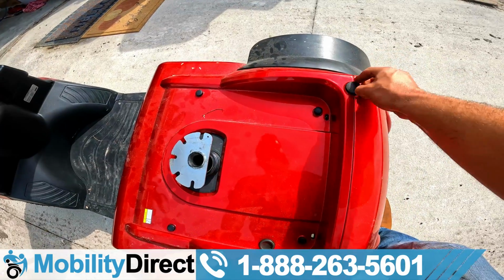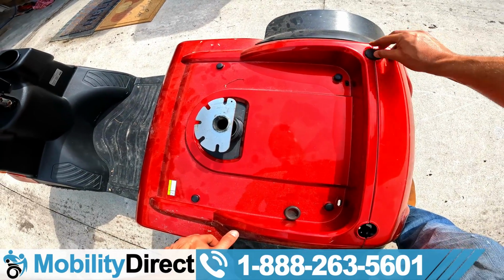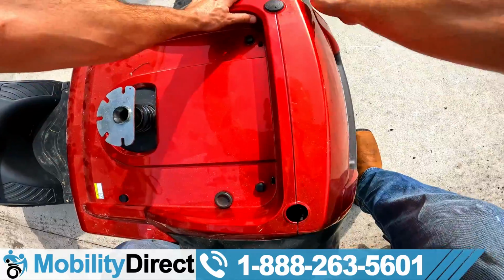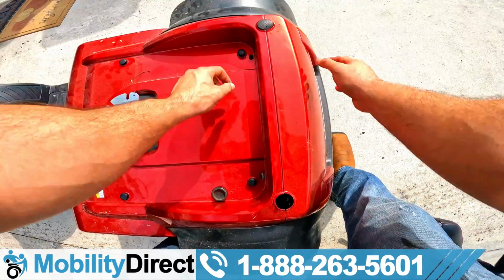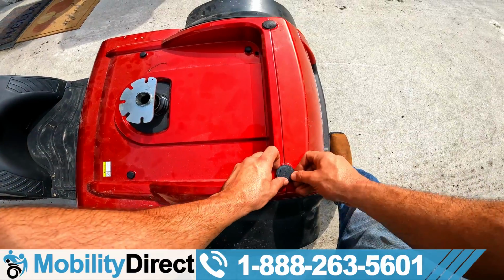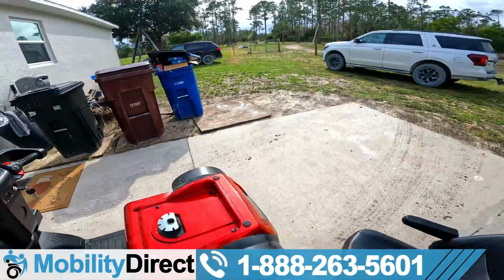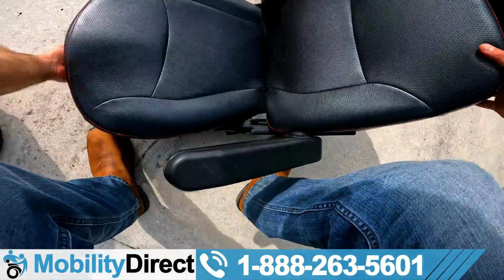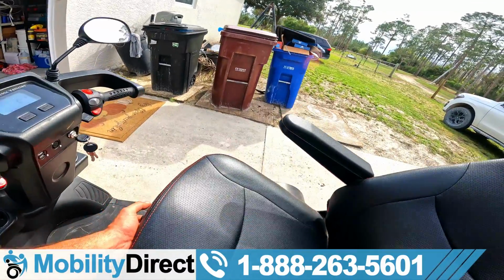All right, folks, so we just got all the 4 screws on. It does take a little bit of maneuvering of the body panel to get everything lined up perfectly. You kind of want to make sure that your seams are all nice and tight here on the back, and if they're not, that's probably going to make it harder to put the hand screws back in. So we've got everything back together as far as the screws and the caps. Let's go ahead and put the seat back on. By the way, you want to lift up that rotation lever while you're dropping the seat in.